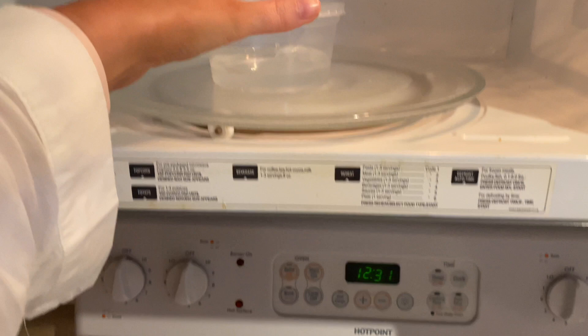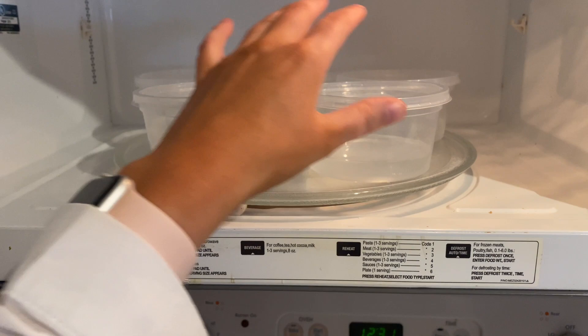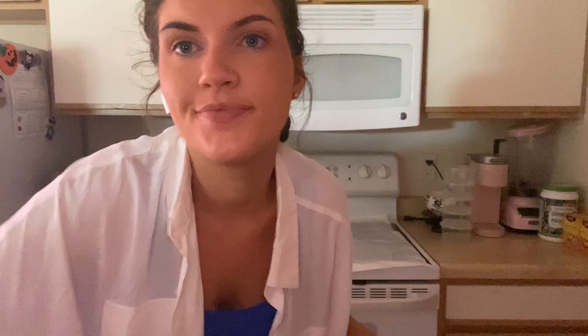You want to make sure these lids are not snapped on — you just want them resting on top. Don't snap them down; that's very important. I've got all five containers in here, lids just resting on top. We're going to close it and start it up for seven minutes. When it's done I will let you guys know what I do.